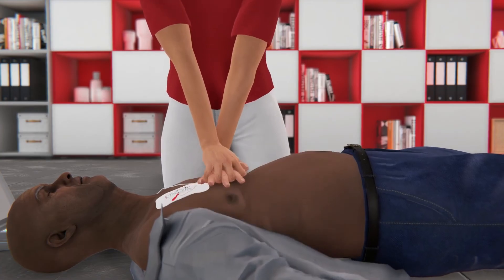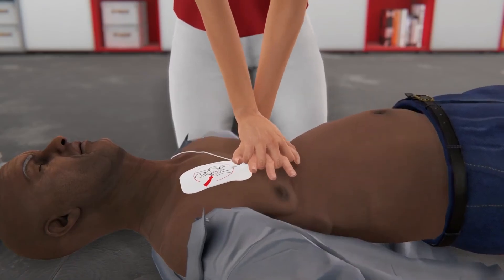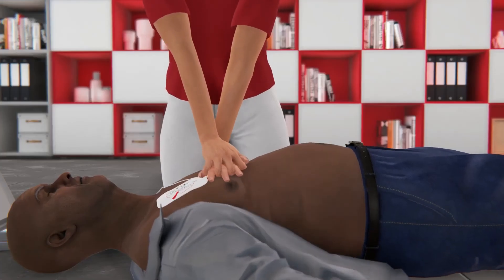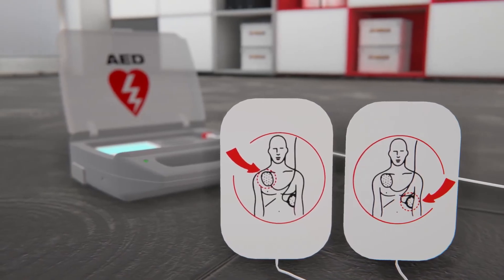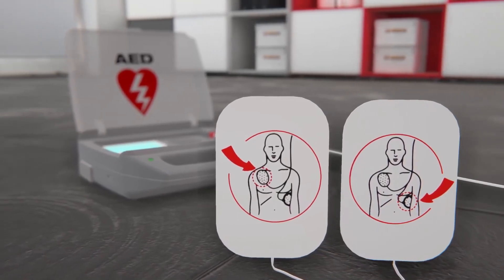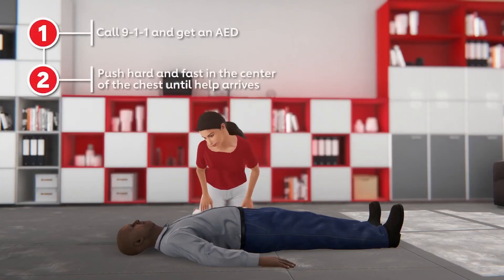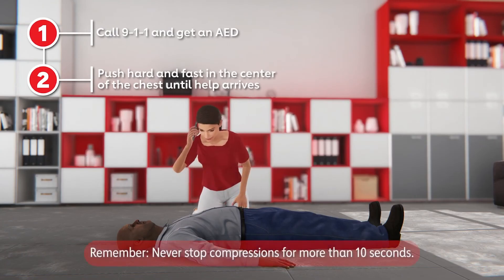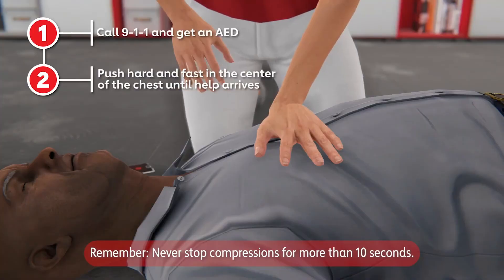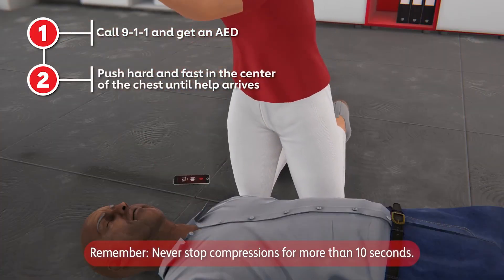Let's hope you never have to use hands-only CPR, but know that CPR combined with using an AED provides the best chance of saving a life. If possible, use an AED every time you provide CPR. If you see a teen or adult suddenly collapse, don't be afraid to start hands-only CPR. Remember: call 911 and ask someone to get an AED, then push hard and fast in the center of the chest until the AED and help arrives.